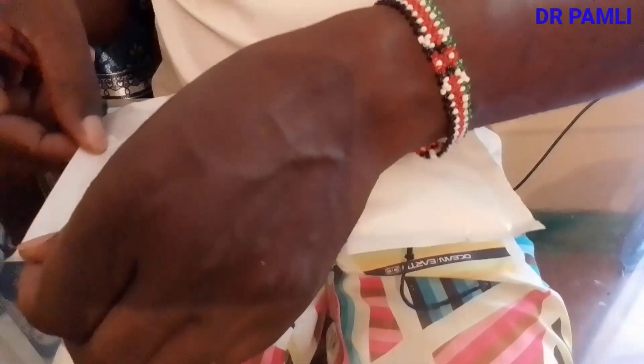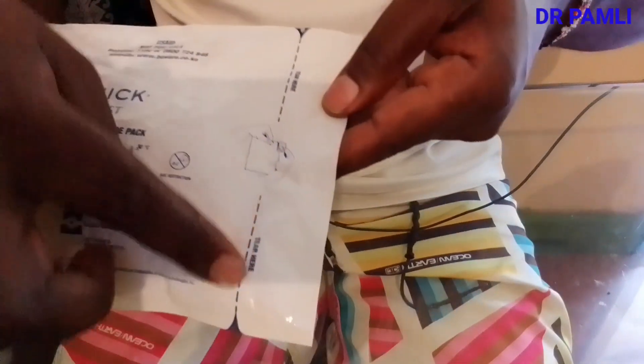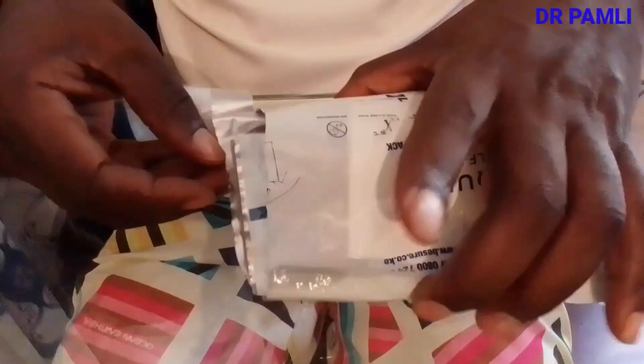Kindly make sure that all the edges of the kit are sealed and there is no leak, because if there's a leak it may interfere with the test result. This is the edge where you look, and this is where you tear the seal along that particular line — do it slowly so that you don't interfere with the materials inside.